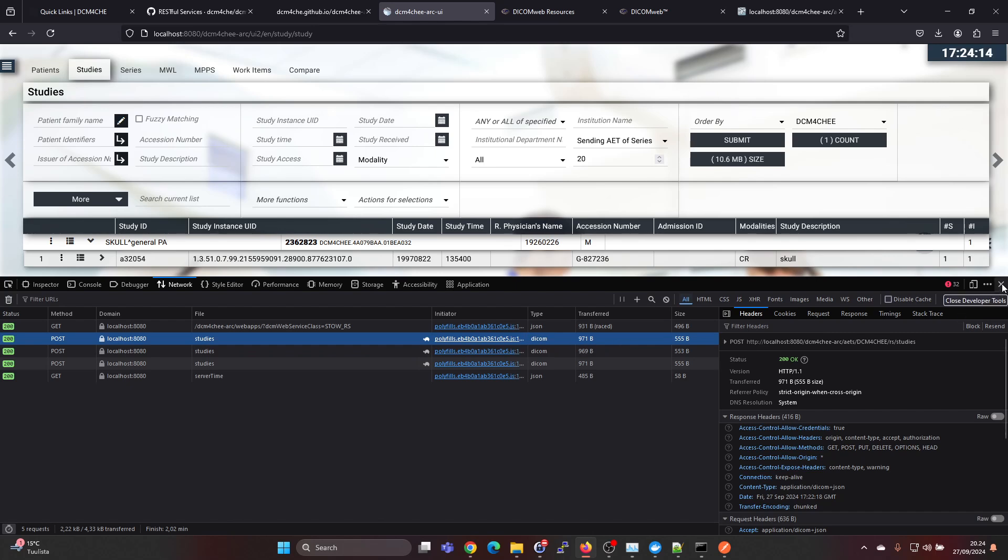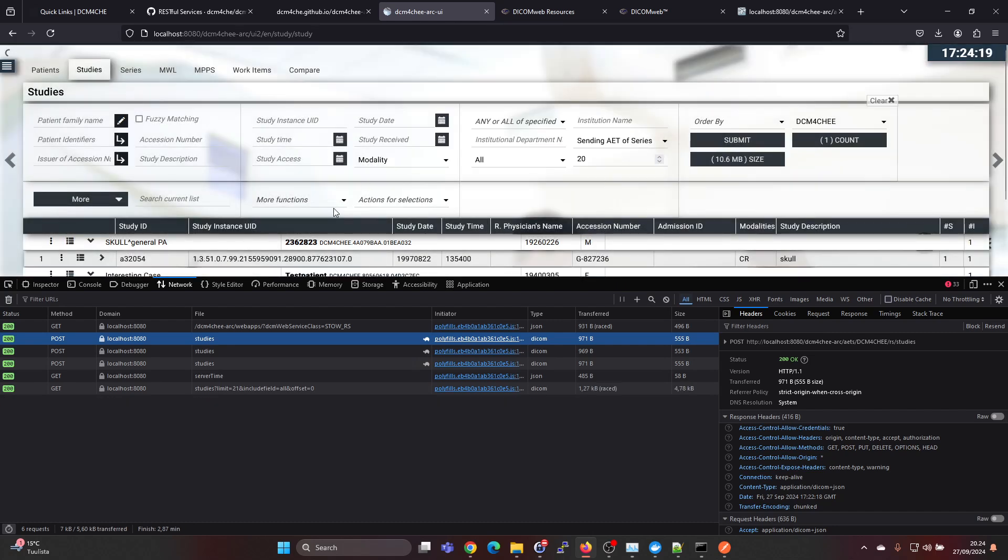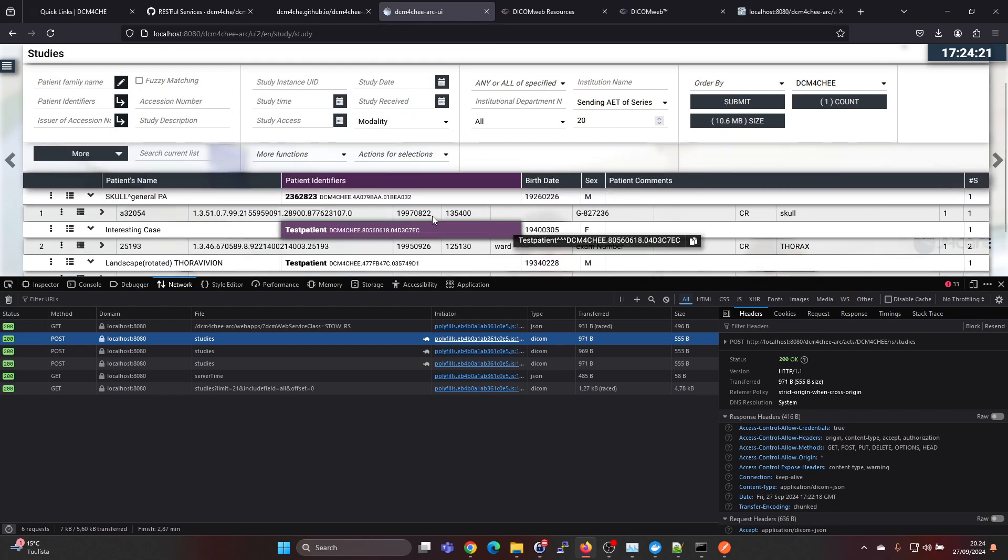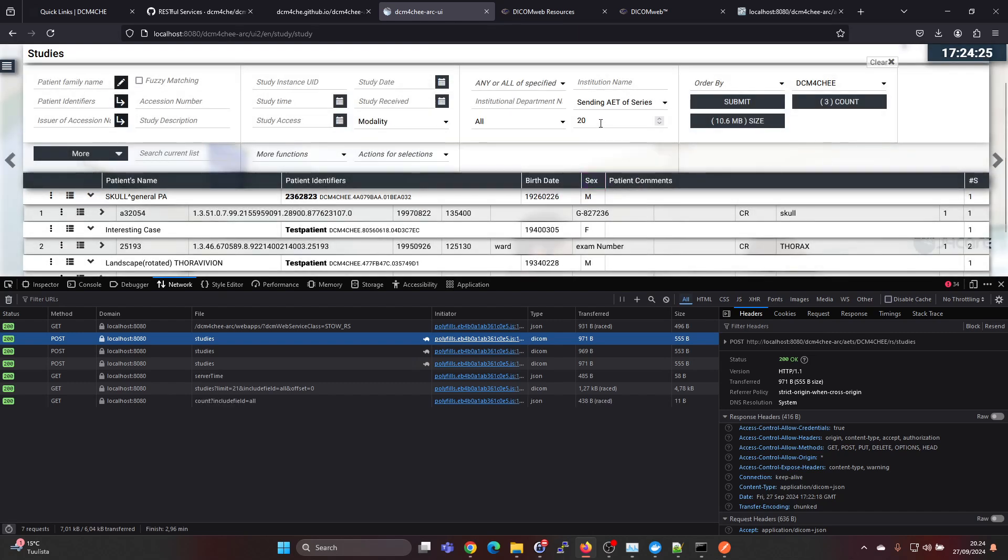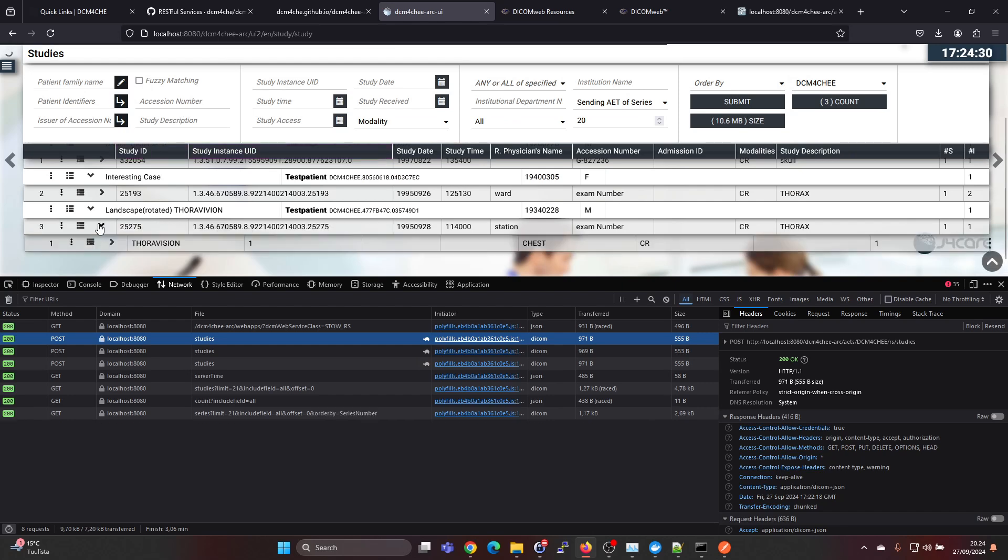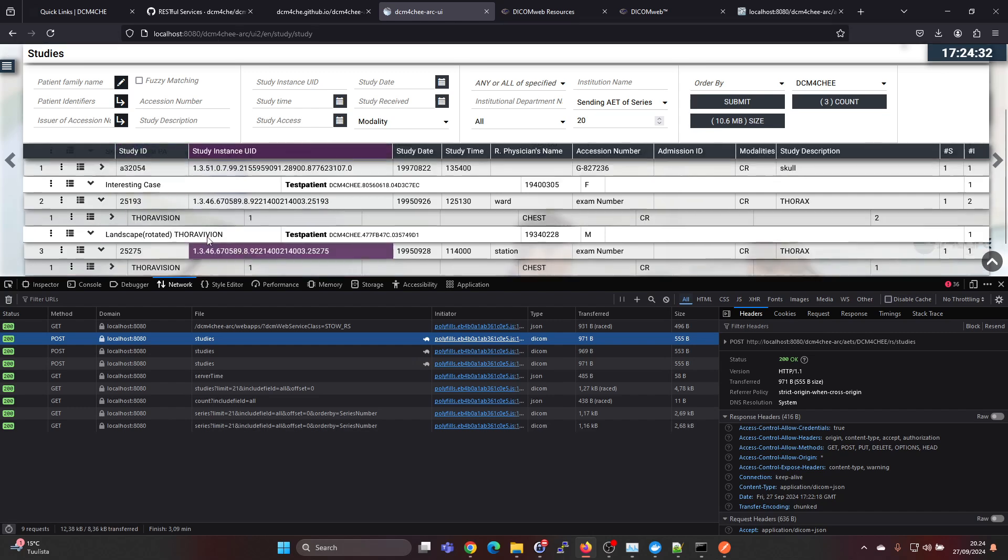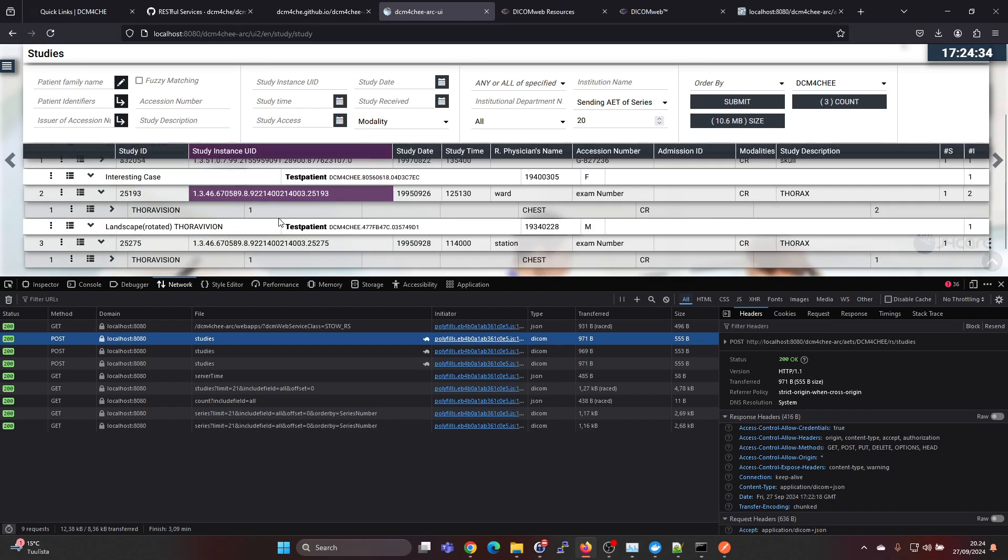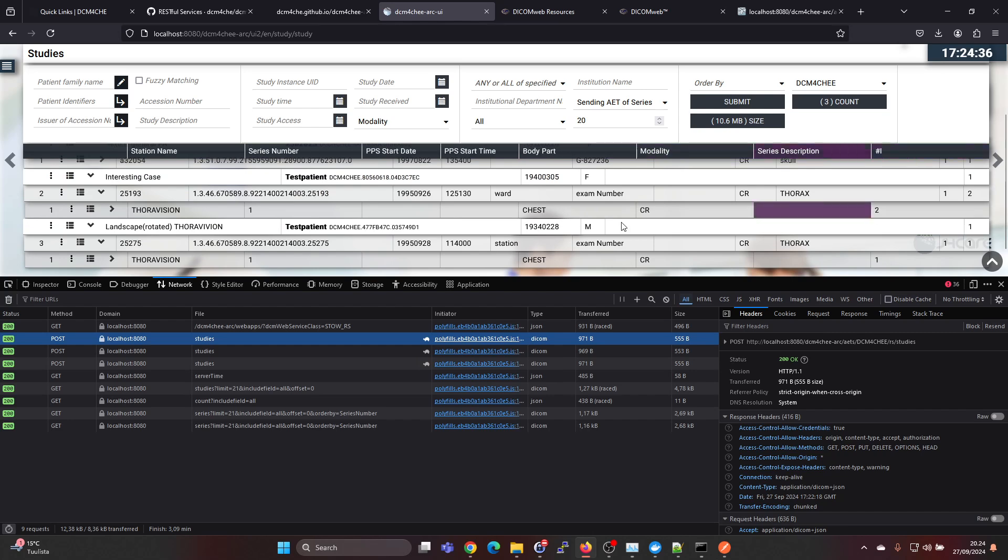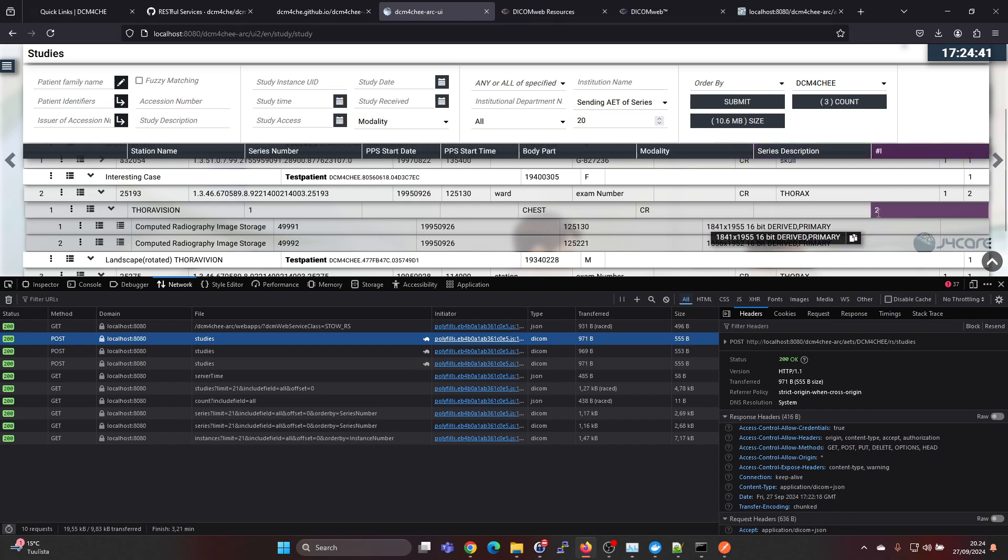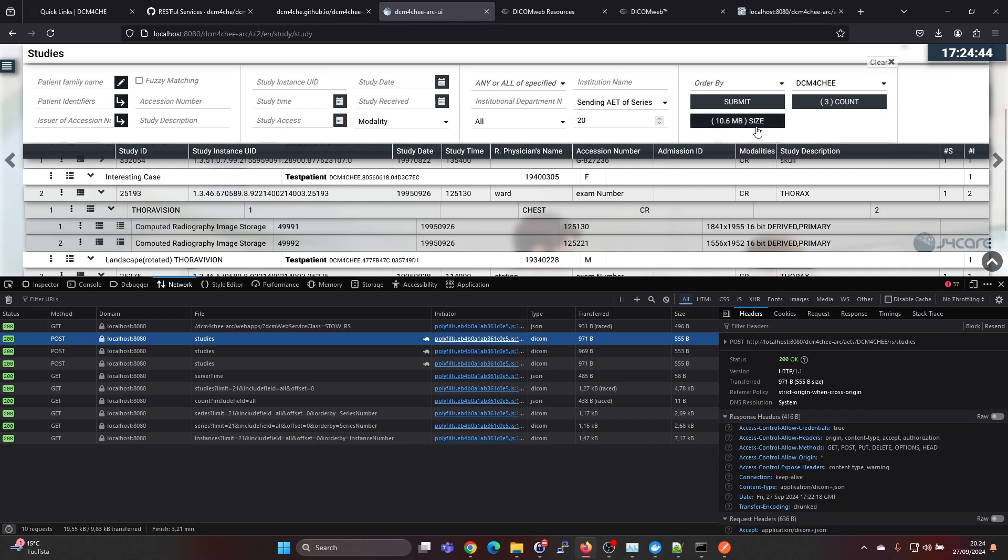Now if you go back here again Dicom4ChE and press on submit we should see some additional content here. We had one study previously, now we have three studies. I guess two of the images were for the same study and one was separate.